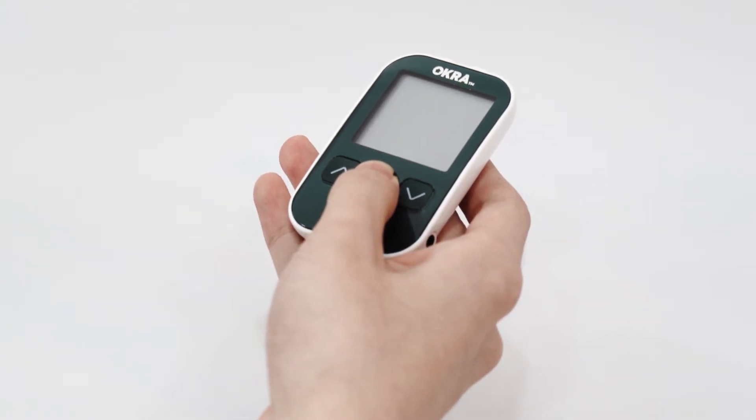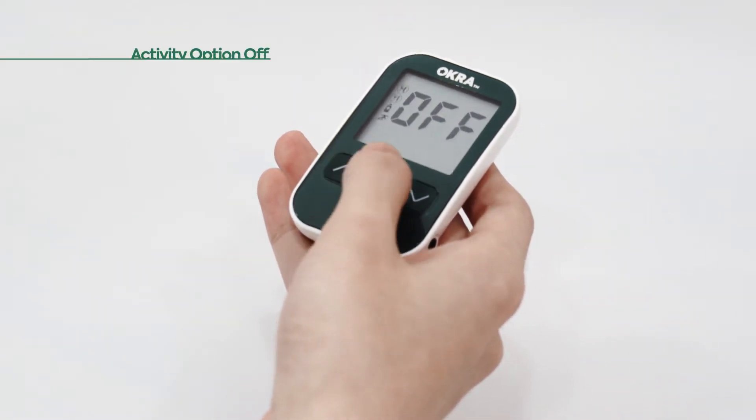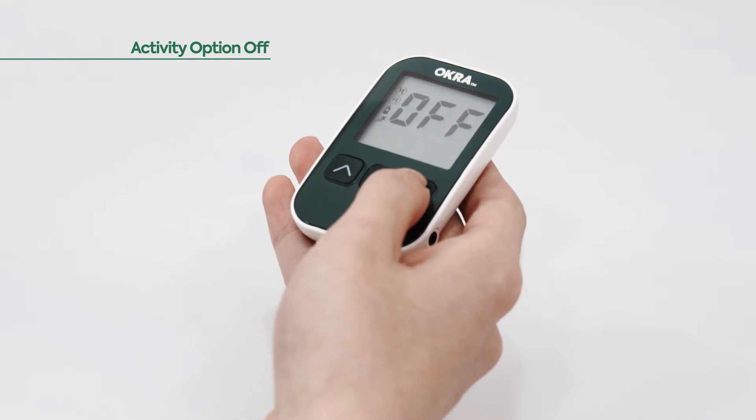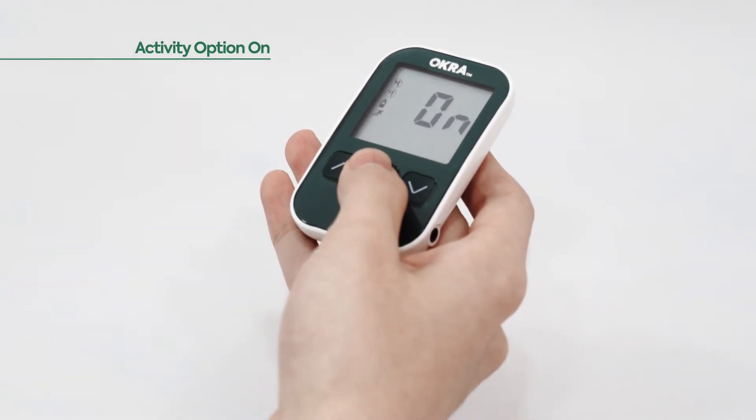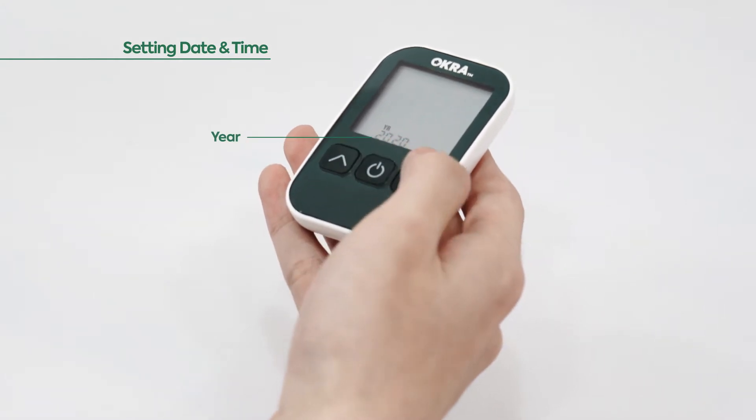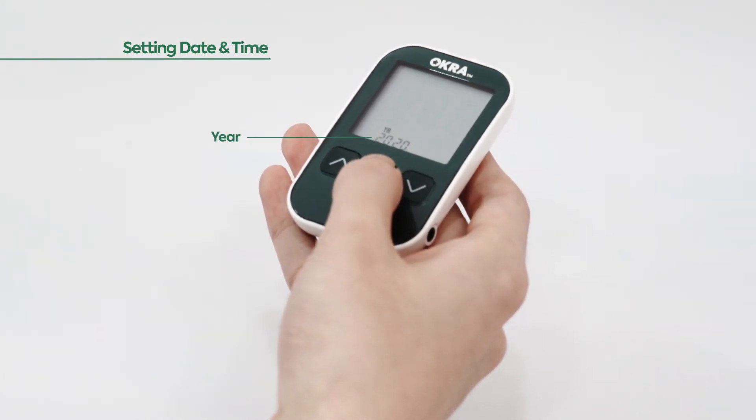Hold for three seconds until you hear the beep sound. Select on or off to set up the activity option, then press the power button to save the setting. Next, change the year, month, day, and time with the up and down buttons, followed by the power button to save the setting.